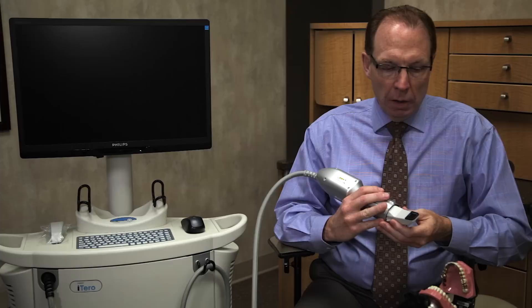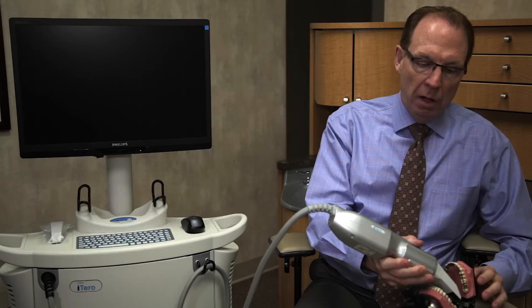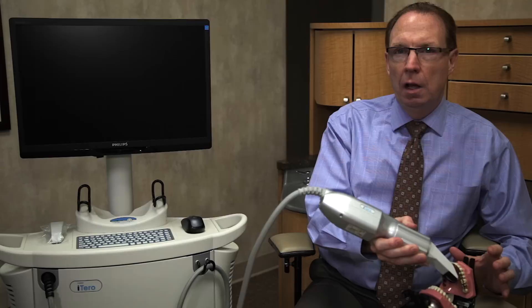It's a very simple process. It just requires the end of this right here to go inside of your mouth, and you'll hear a little beep every now and again, and we would change the position and it would beep again, and you'll be able to see in a moment how that's created on the screen.